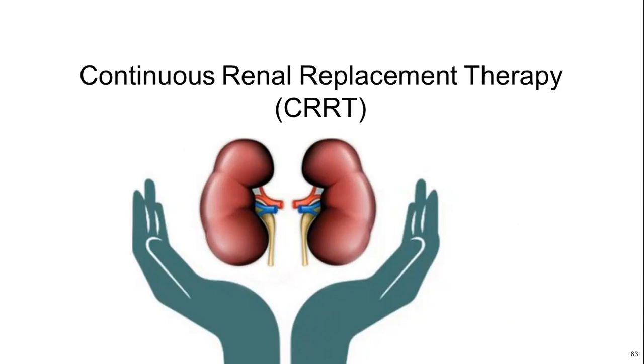Instead of doing it over 4 hours, continuous renal replacement therapy is done 24 hours a day to slowly and continuously clear out waste products and fluid from the patient.